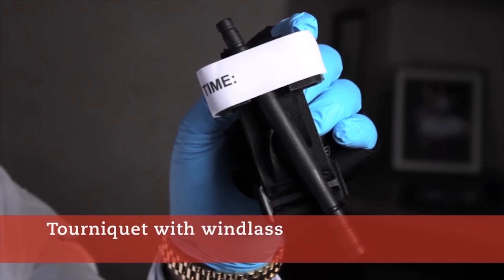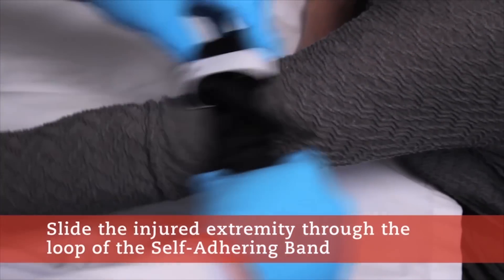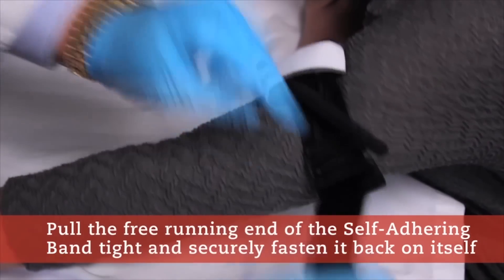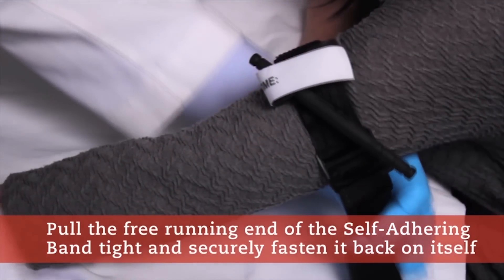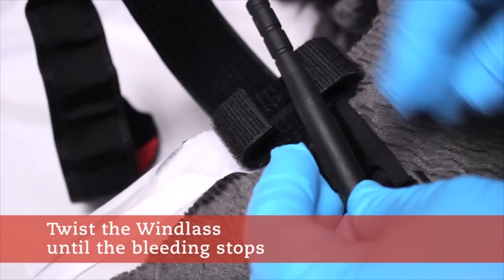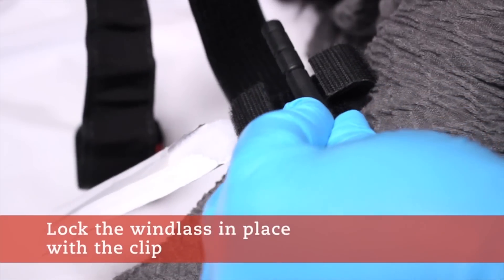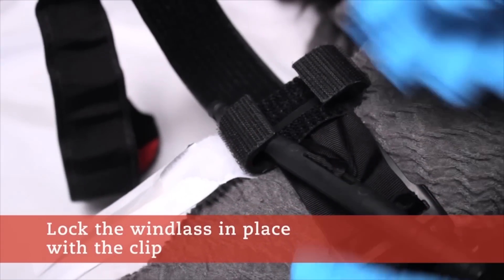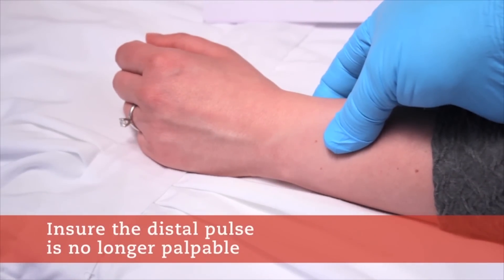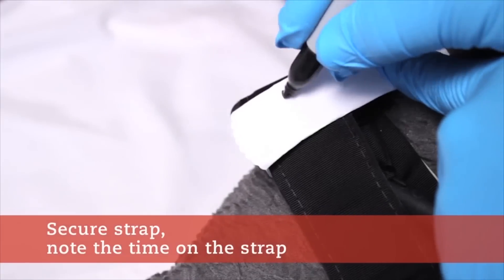These are the steps for a tourniquet with a windlass. Slide the injured extremity through the loop of the self-adhering band. Pull the free-running end of the self-adhering band tight and securely fasten it back on itself. Twist the windlass until the bleeding stops. Lock the windlass in place with the clip. Ensure the distal pulse is no longer palpable. Write the time on the strap.